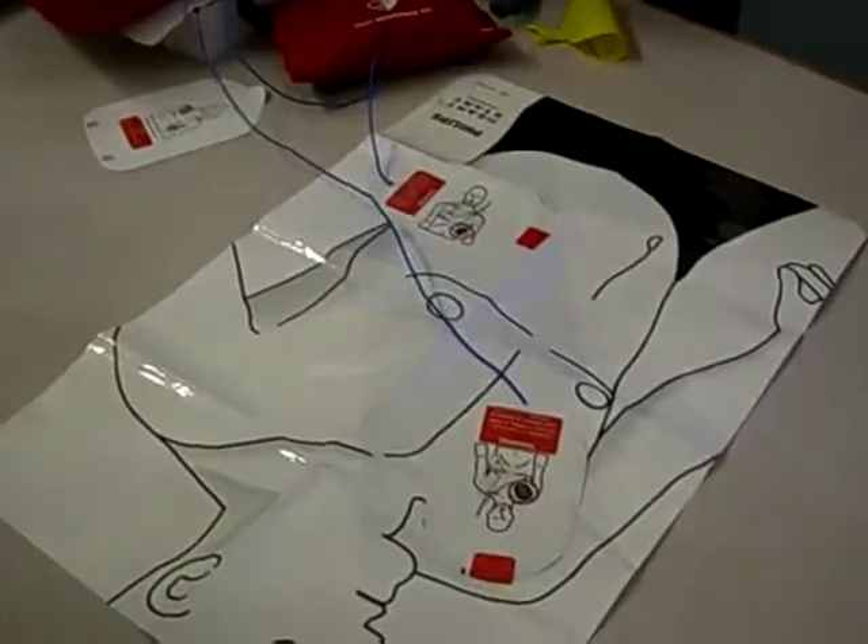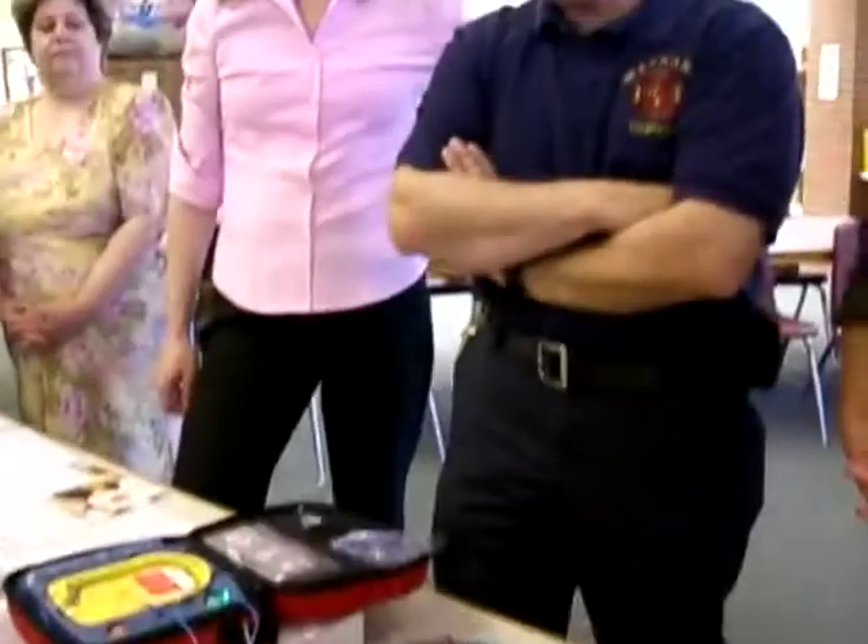Shock advised. Stay clear of patient. Just make sure nobody's touching them. Push the button. That's awesome. That's cool.